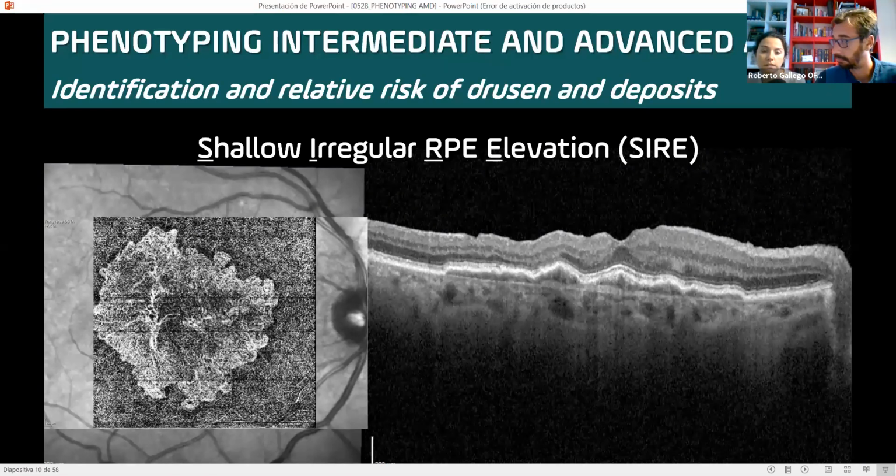Well, you can see that maybe in pachychoroid disease. It's quite typical, this kind of type 1 neovascularization below the RPE. Okay, we will go into further detail later. So an OCTA in such cases might be helpful, right? Sure, yeah. Although if you don't have it, you can suspect by the aspect of the content of the RPE, but it's really useful for these cases.